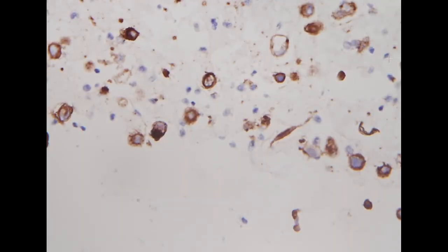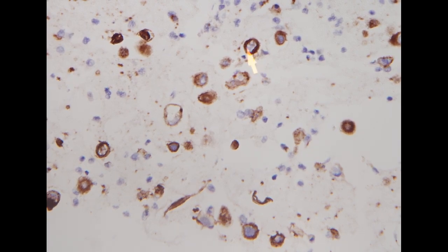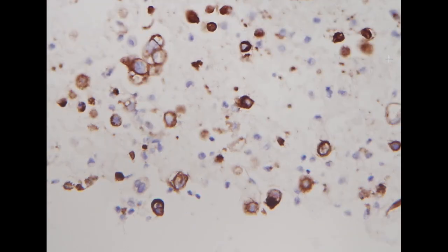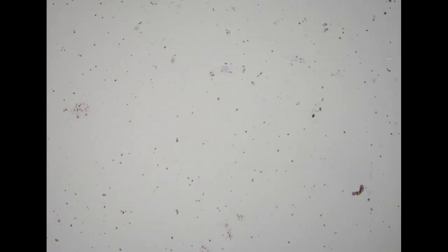So I would say this specimen is quite difficult because these cells are basically indistinguishable based on the cytomorphology from the adjacent histiocytes or reactive mesothelial cells. So in this scenario, immunohistochemistry is very helpful for us to confirm. The patient had a past history of pancreas cancer, so it has already developed this poorly differentiated morphology as single cells.